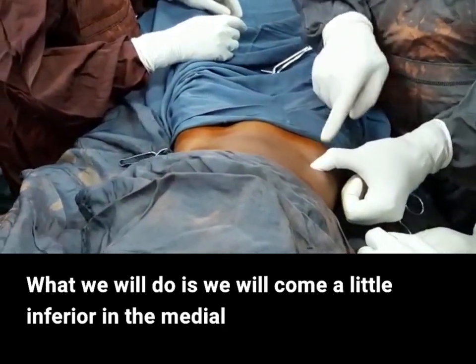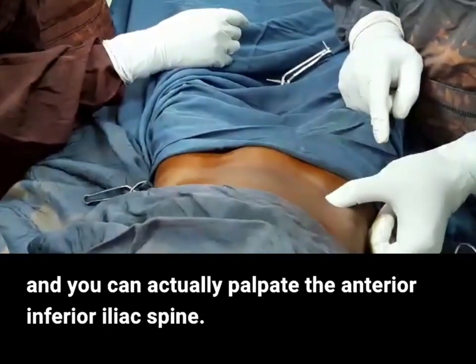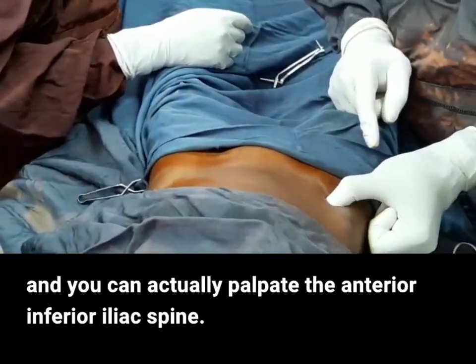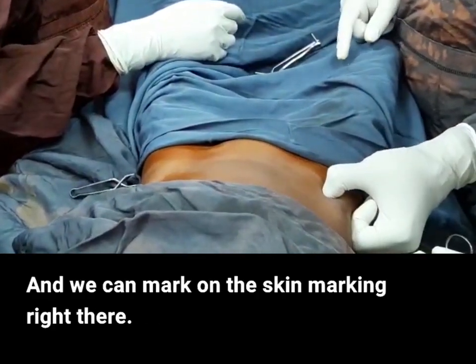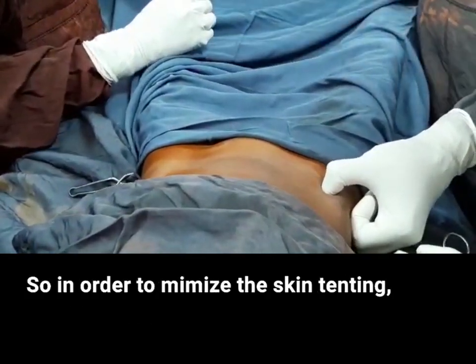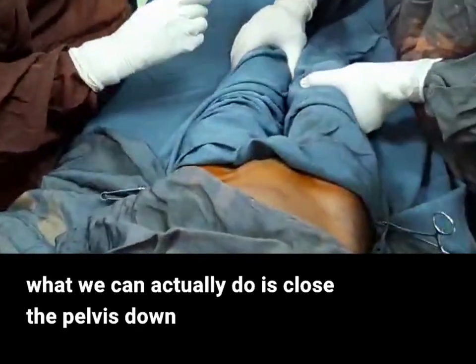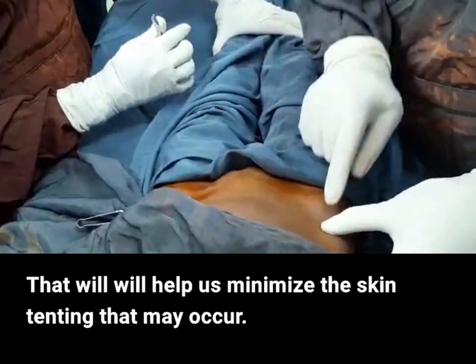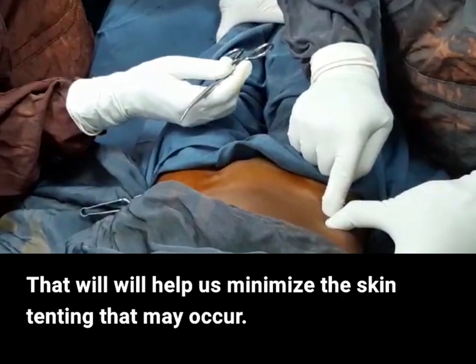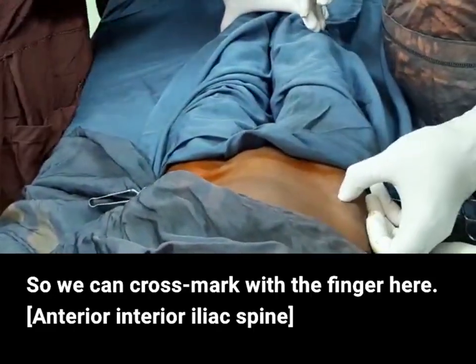This is the anterior-inferior iliac spine (AIIS). What we'll do is come a little inferior and medial. We can actually palpate the AIIS in a thin patient like this one, and we can mark the skin right here. In order to minimize skin tenting, we can close the pelvis down by bringing both lower extremities together. That will help us minimize skin tenting. Knife please. You can cross-mark with the finger here.